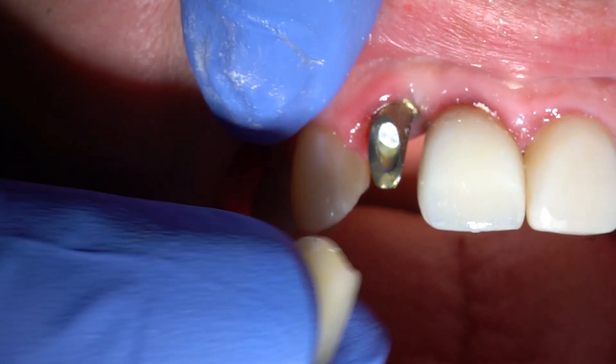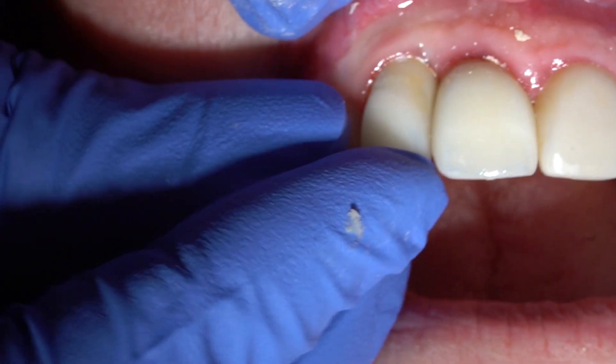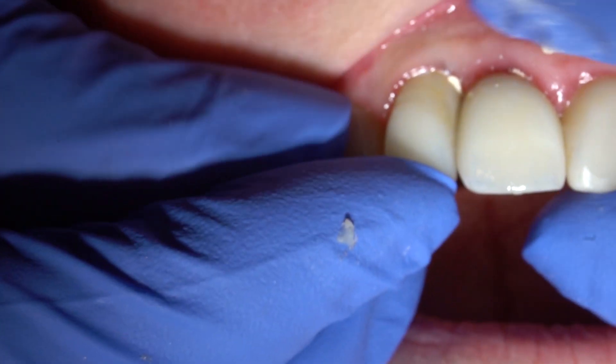There are two ways that we can attach the tooth. Putting the implant in is phase one, and phase two is connecting the tooth onto the implant. We could have the tooth made exactly like a crown on a natural tooth and glue it onto your implant. It seems pretty straightforward — we've been gluing crowns onto teeth forever and it works really well.